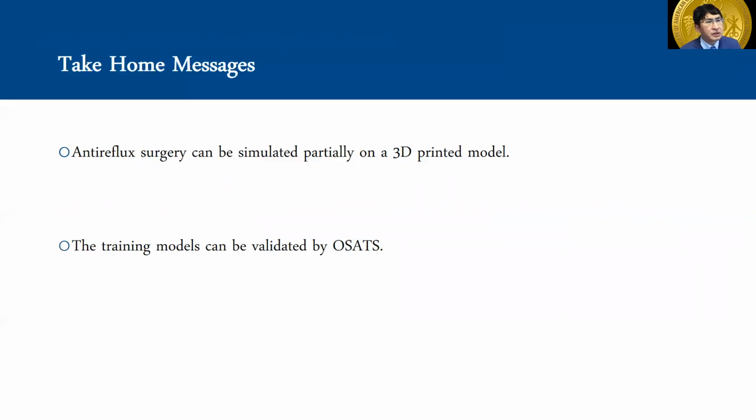The take-home message: anti-reflux surgery can be simulated partially on a 3D printed model, and the training model can be validated by all OSATS.